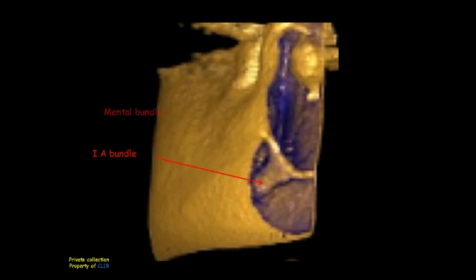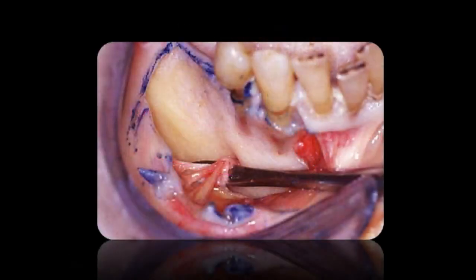On this 3D representation, you can also see the splitting. After exiting through the mental canal, the mental nerve will be divided into three branches and will give innervation to the buccal gingiva, the vestibule, and the lower lip.